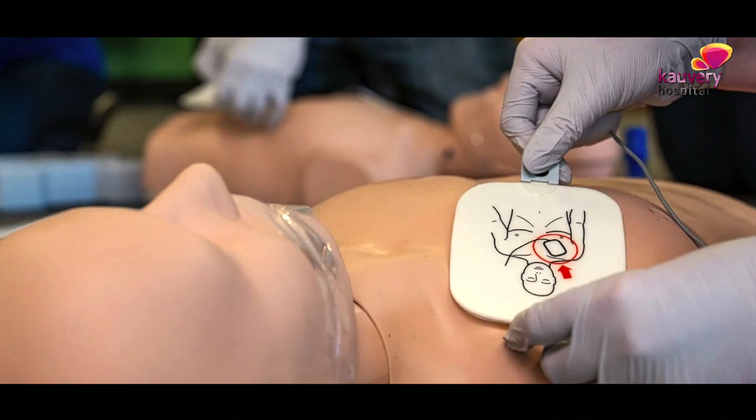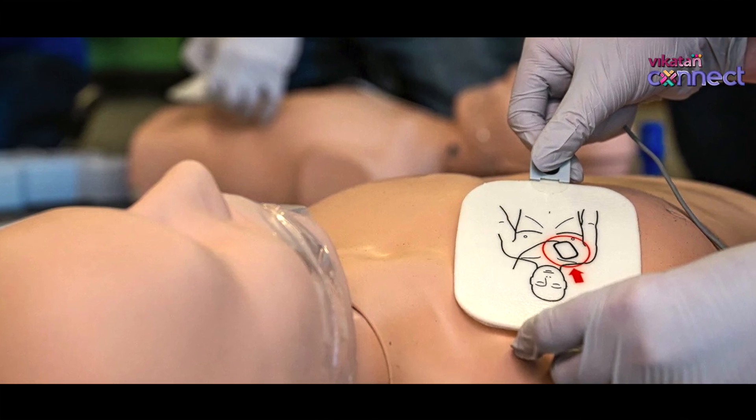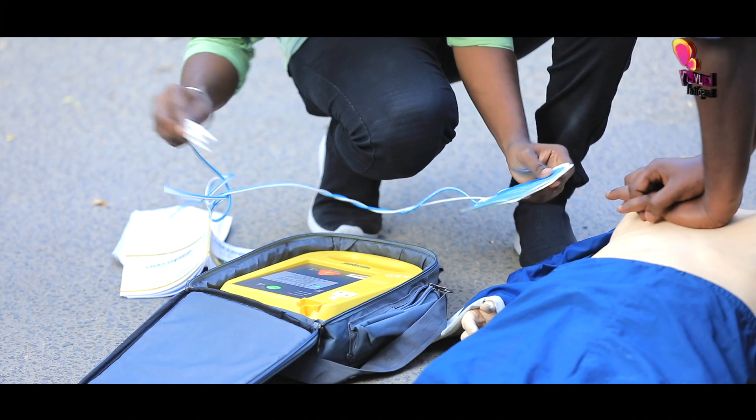There is a diagram on the pad showing exactly where to place it, so you don't need to guess. If you look at the pictures on the pad, you will know where to go. The pad is applied directly to the patient's bare body. First, expose the patient and lay them on a flat surface. If the skin is dry, you will be able to peel the pad and attach it to the patient's body.